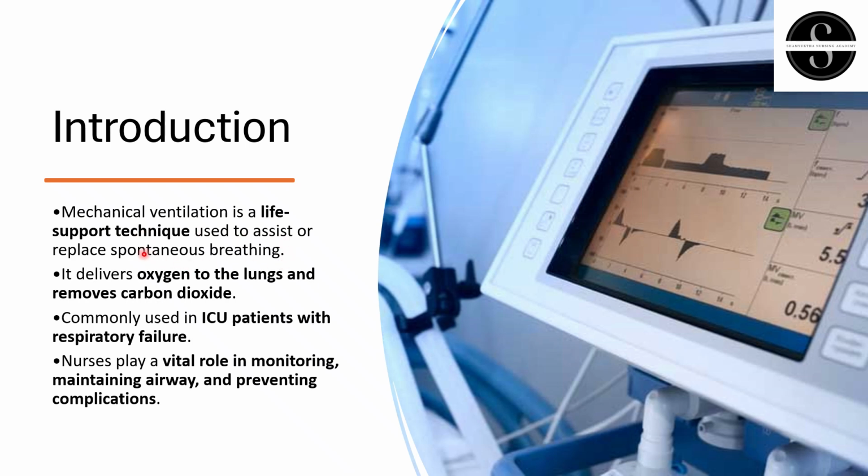When the patient is unable to breathe spontaneously or normally, they need some sort of machine, which is called a mechanical ventilator. Clear? This is the simple term for mechanical ventilation.